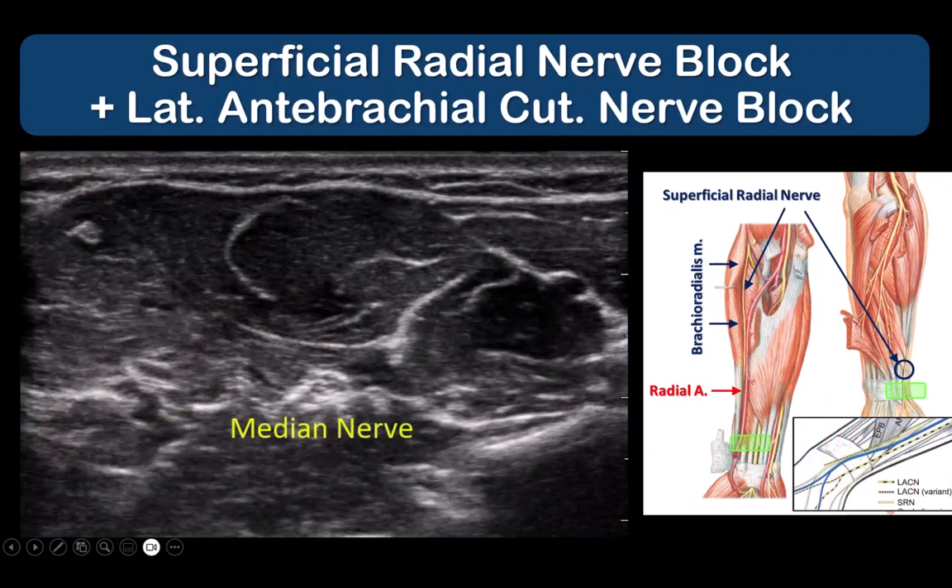Both of these nerves can be blocked in the same pass using a 25-gauge hypodermic needle. Place the probe in a transverse orientation halfway along the patient's supinated forearm. The median nerve is usually visible here. Slide the probe in a lateral direction from the median nerve to find the radial artery and brachioradialis, and look for the superficial radial nerve lateral to the artery.